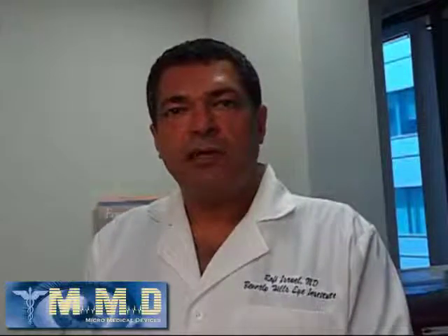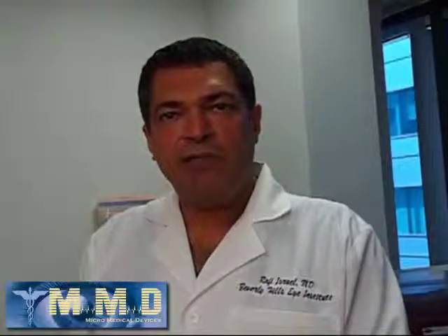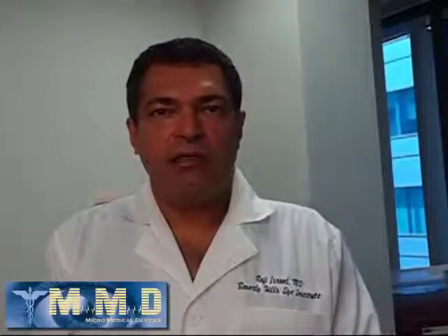Now I would like to talk about some of the reasons that my colleagues might have difficulty in capturing with the EZ Immersion Tip. The number one reason, in my opinion, is not having the right alignment. So what most of the techs I've seen do, if they're not aligned properly in the eye, they tend to press hard on the eye.